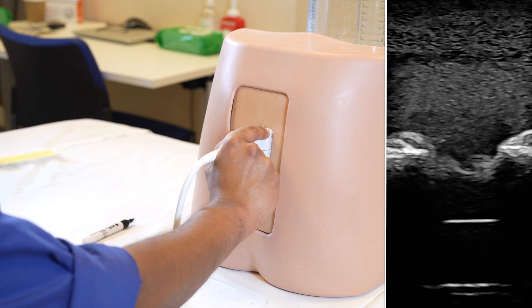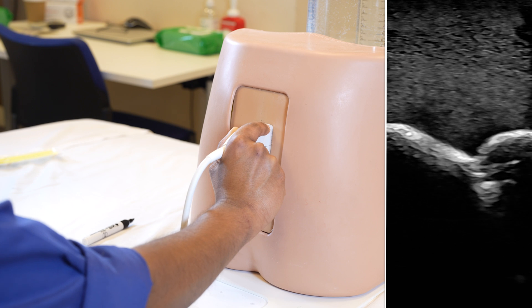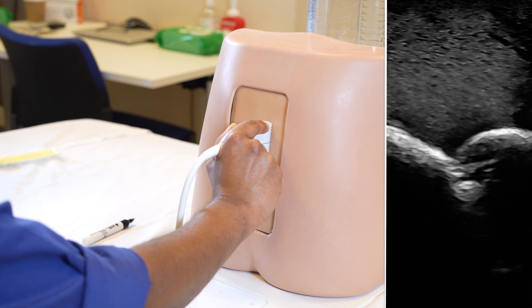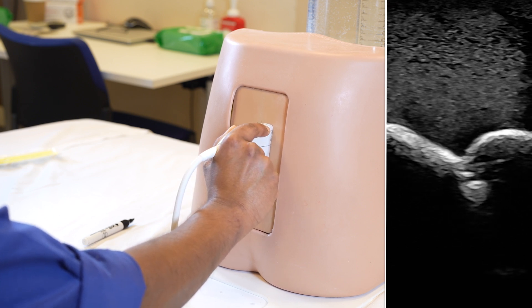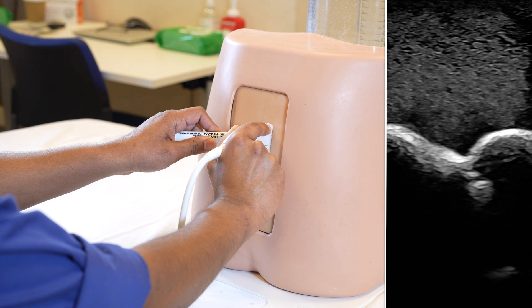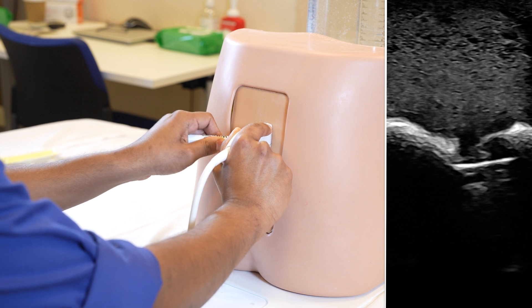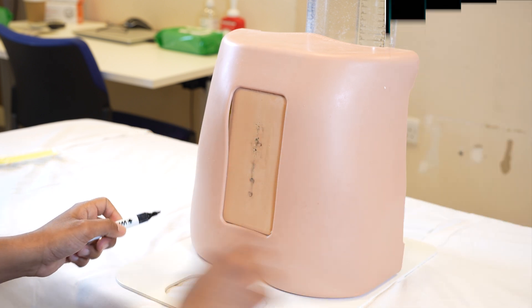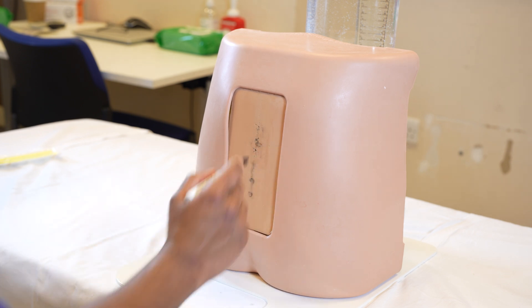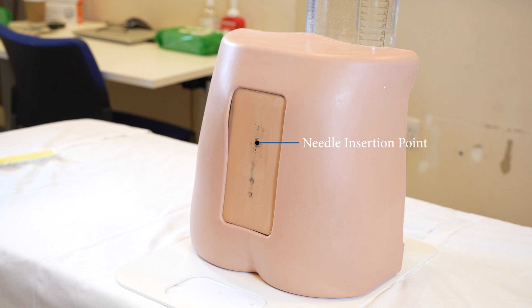Once you get that view, you tilt back to the midline gradually until you get the interlaminar space, and you want that in the midline. You don't want the hump in the midline — you want the interlaminar space in the midline. Once you have it reasonably in the midline, mark that level with the marker. Take the probe out, you've got the interlaminar space marked. Extrapolate back to the midline, and where it crosses the midline is the exact point where your needle must be inserted — that's for L3 and L4.